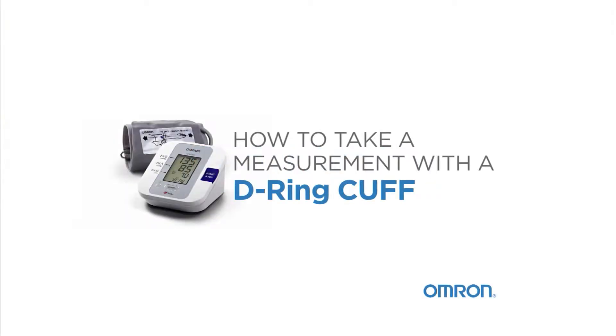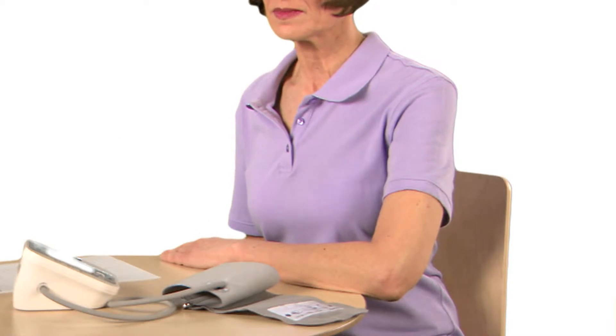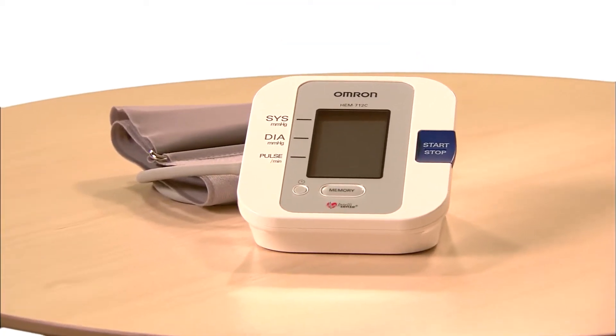Taking your blood pressure at home is easy. Before you take a measurement, follow a few tips to ensure you get accurate readings.